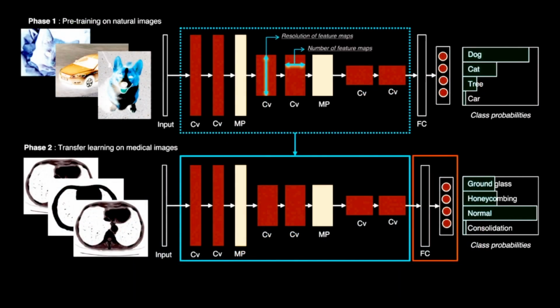labels. Here's an example of transfer learning, where a network is initialized using weights derived from training on a large dataset. Only a portion of the network, typically the final fully connected FC layers outlined here, needs to be retrained for a new, smaller dataset. The underlying assumption is that basic image features may be shared among seemingly disparate datasets. The height and width of red boxes, respectively, represent the resolution and number of feature maps resulting from the current layer operation.